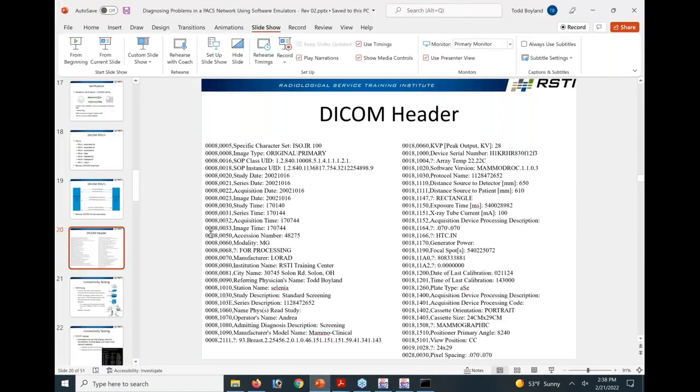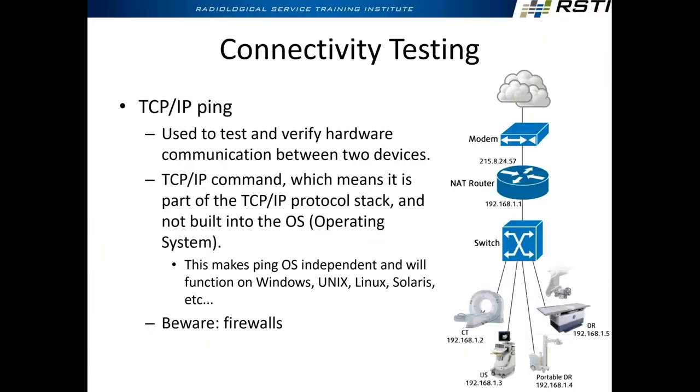All right, so we got about, what, 20 minutes here? Let's get into some of this meat and potato stuff here. So let's go back to whatever page this was right here, 19. This is just saying, make sure TCP/IP works first, because all this is moving over it. I have a note here about the firewalls with that. Because they suck. A firewall could give an indication you have a hardware problem, but really it's the firewall blocking.